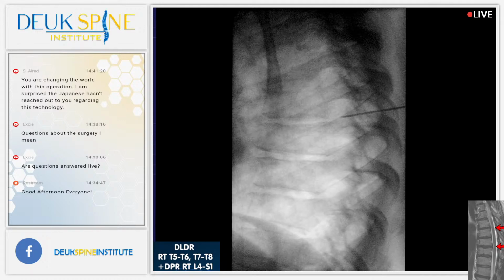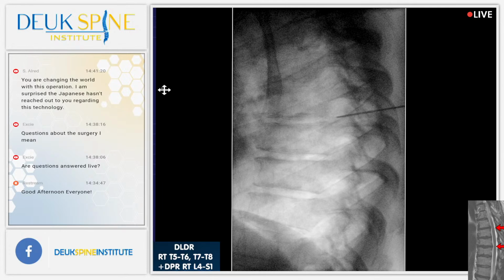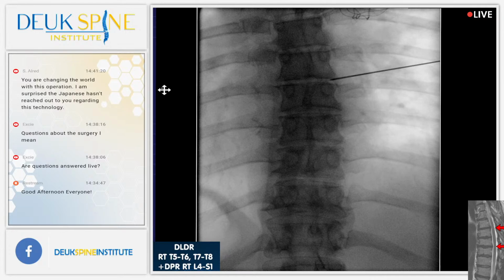Now we're around the facet. You doing all right? Give me an AP. I can't hear her. You've got to tell me what she's saying. She said she's still fine. Good. Everything's going well right now for you. Henry, do you have a good view of the MRI? Yes, we do. It looks really good right there. That looks really good on the AP.